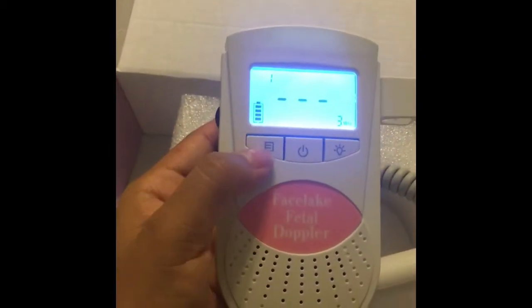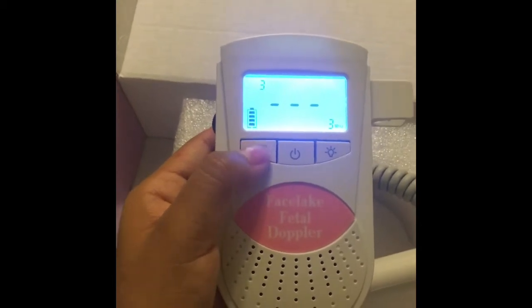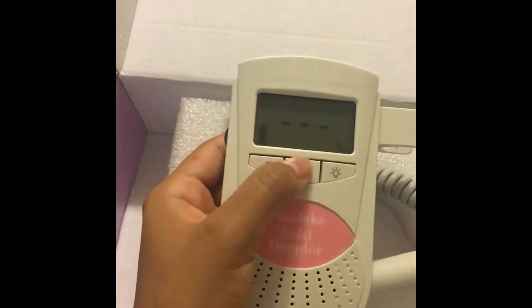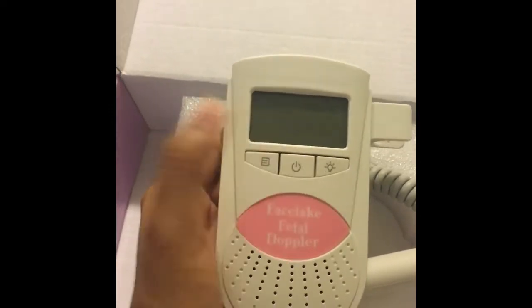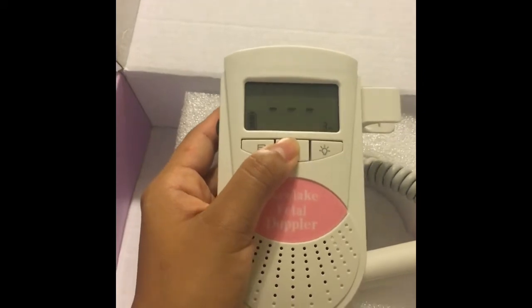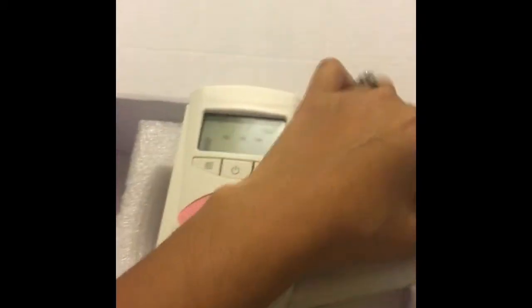It has different number settings you can adjust. I'll show you guys how to use it in a few minutes. It also has different lights. If you want to turn it off, just press it and it turns off. Turn it back on again and you can use the full volume — it's adjustable.